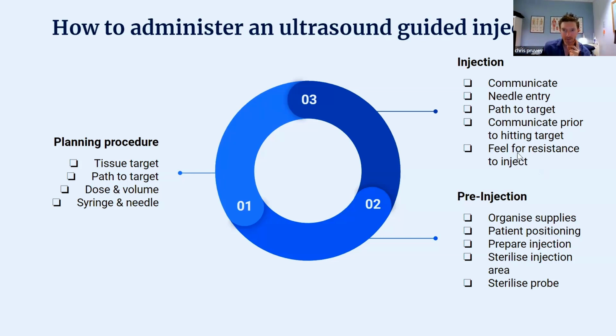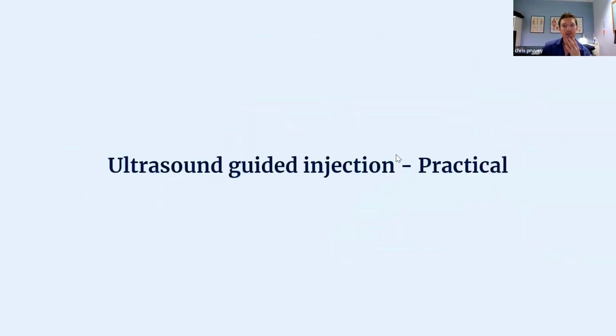I always communicate. I generally say to people, right, the thing that everyone says is sharp scratch, right? So now we're in, but then I always tell them, this is the bit that might be a bit sore. It's not terrible. It's always worth doing that so people don't jump, because generally you won't feel the needle go in and down to the area. It'll just be when you get there and you'll feel it a bit. And that's really how you do it.